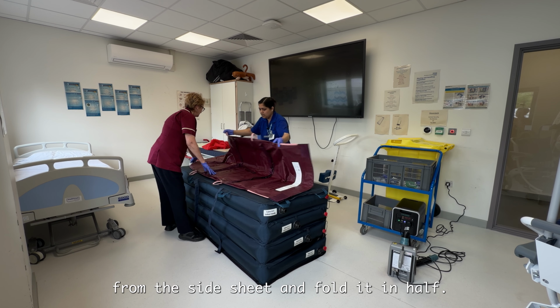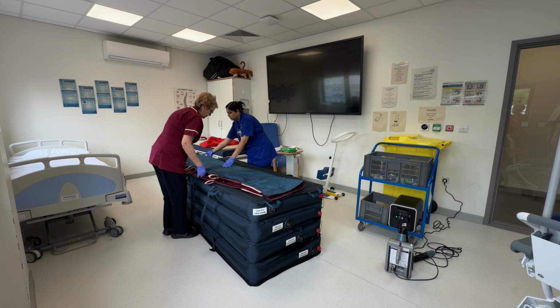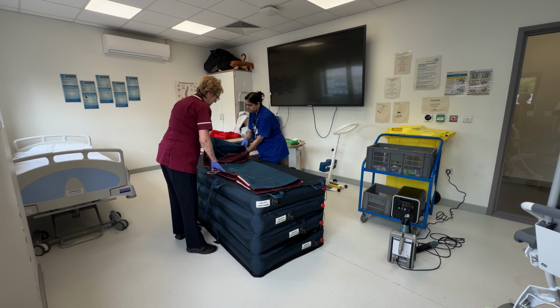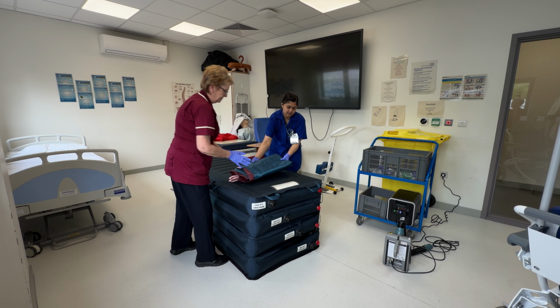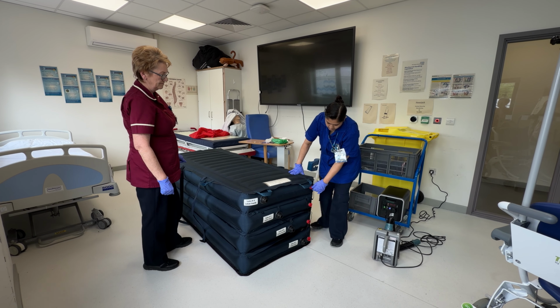And then fold it in half. And then start folding. And then we deflate the hover mattress.